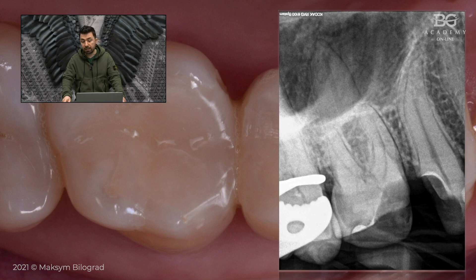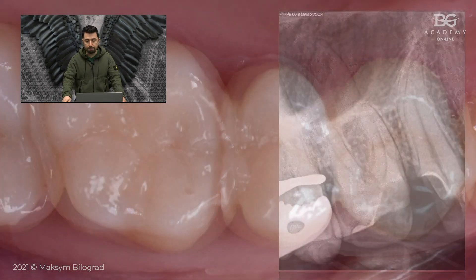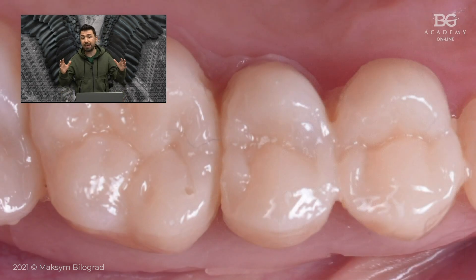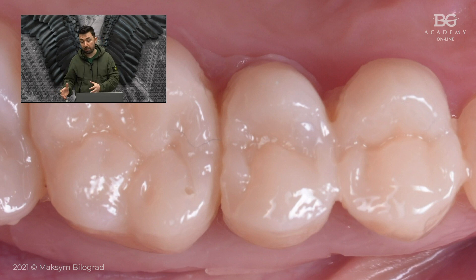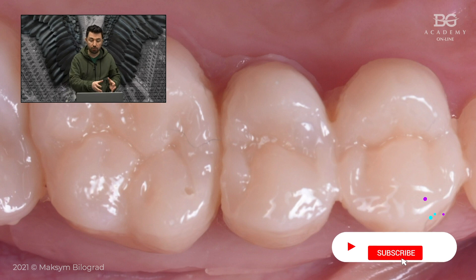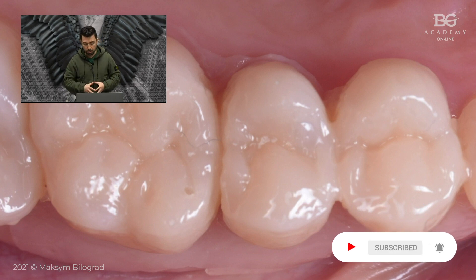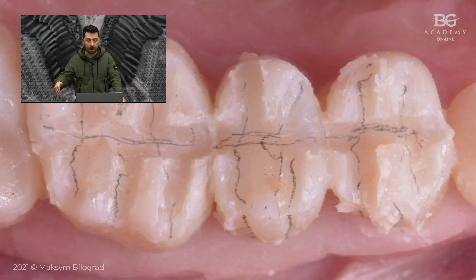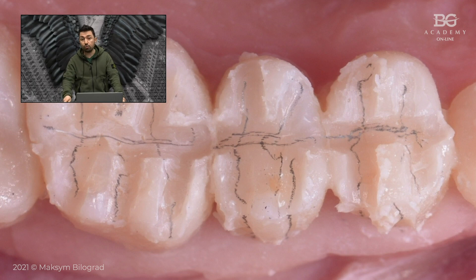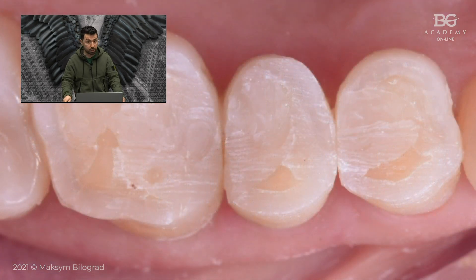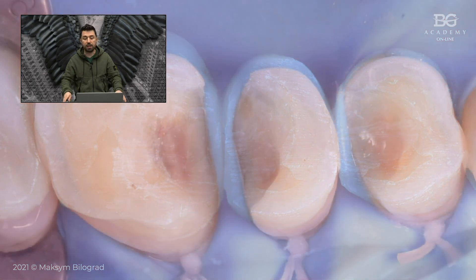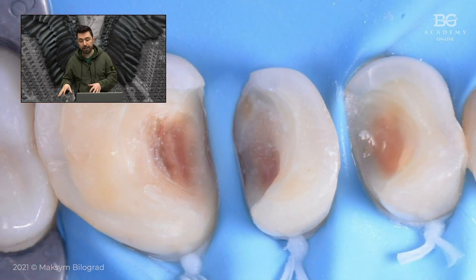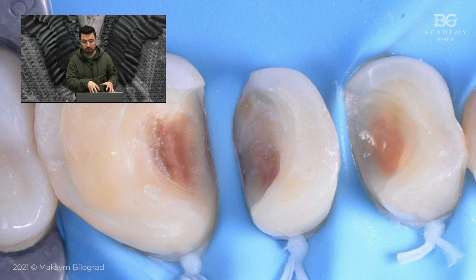As I told you, this is a big case — a full mouth rehab case. We planned the case, made the wax-up, and transferred the wax-up into the patient's mouth. You can see in the mock-up we checked occlusion, started preparations, and practiced through the mock-up. This procedure helps us preserve as much tooth structure as possible. After step one of preparation, we removed caries defects and old restorations.